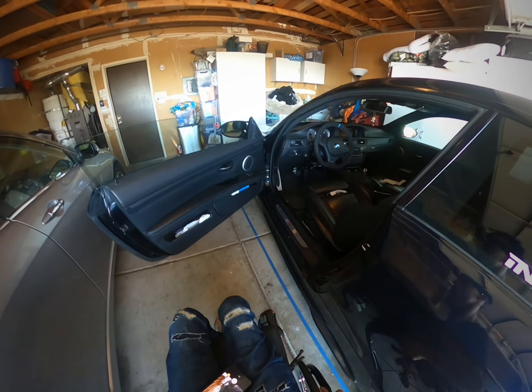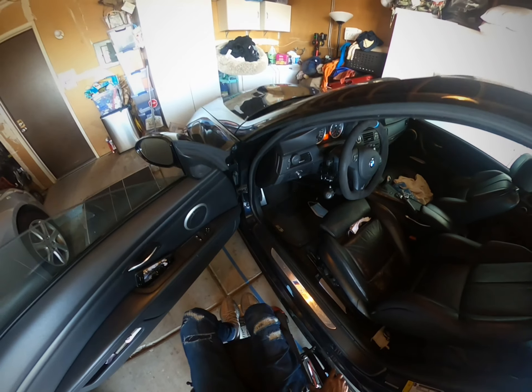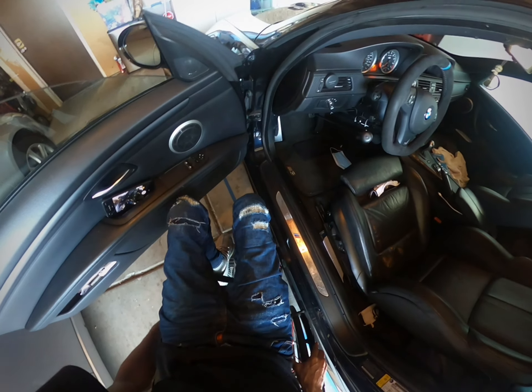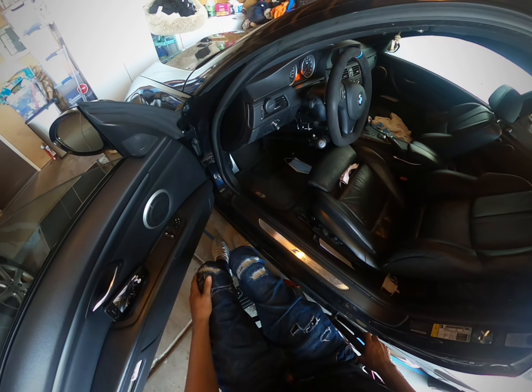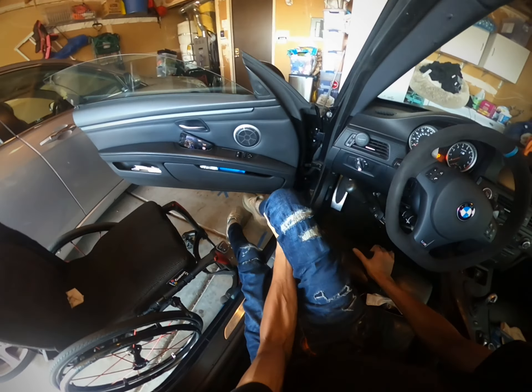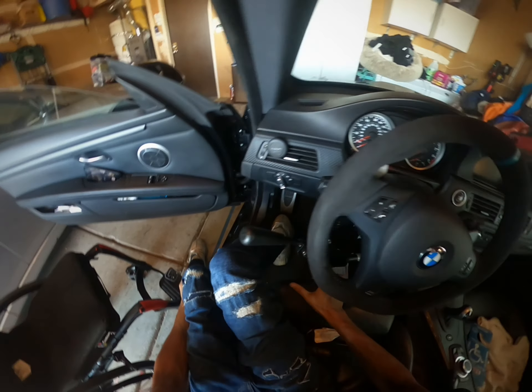This is how I get into the car — I block my chair, set my phone there, and I have to set my feet on the ground. I can place my hand here and then I just hop over. That's always great when my leg spasms.